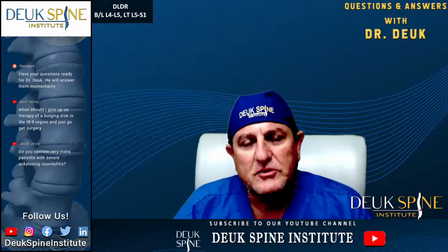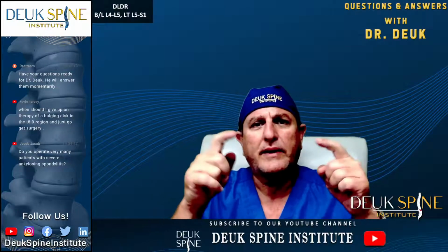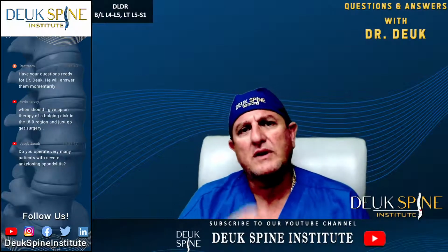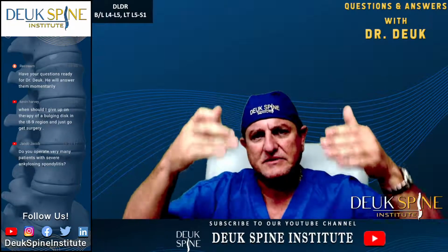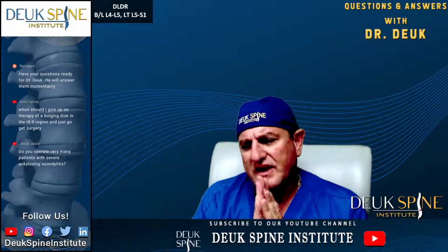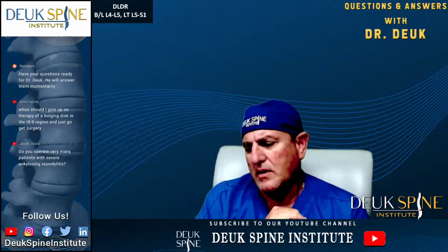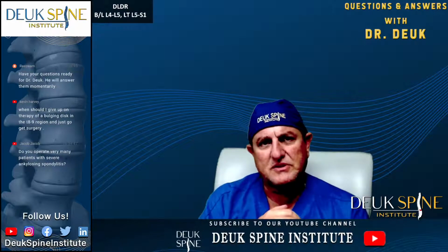Dr. Deuk here. We're just wrapping up our surgery where we did a bilateral L4-5 and a left-sided L5-S1 Deuk laser disc repair. We fixed 2 herniated discs. One was L4-5 on both sides because the patient had leg symptoms on both sides. And when you looked at his MRI, you could actually see the L4-5 disc bulging out on both sides, left and right, hitting the nerve roots coming down. And that's what we found in the operation. And then on the L5-S1, it was just the left side.